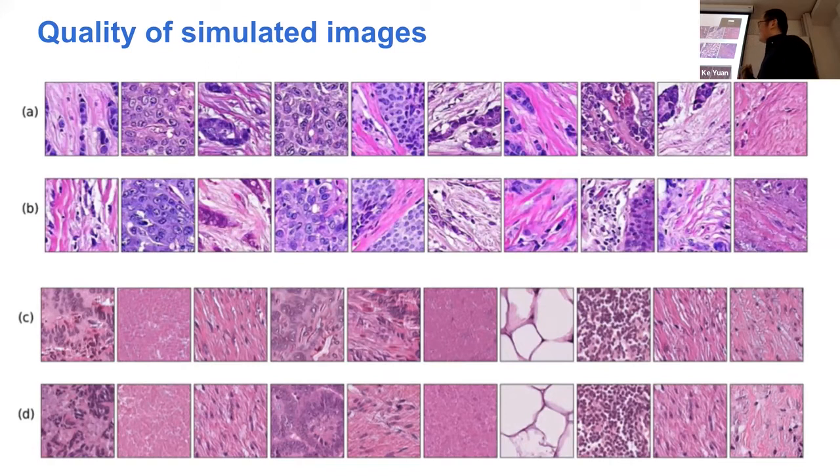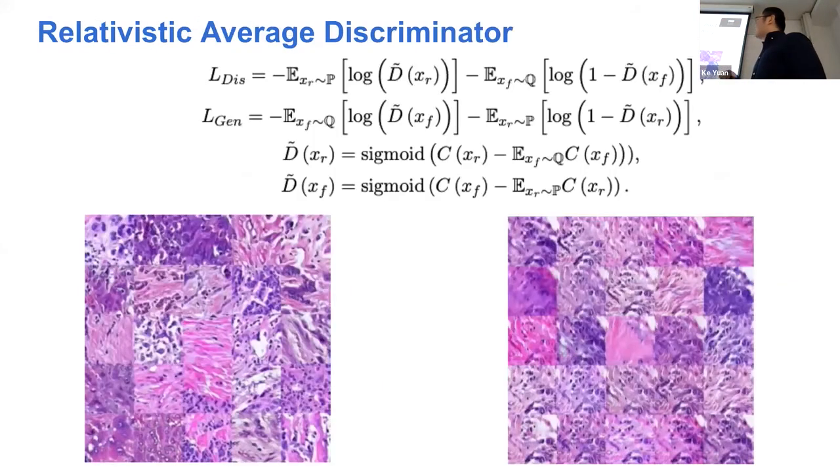So at this point, we're fairly convinced. Of course, you can also assess the FID metrics to have a quantitative measure of the actual quality of the data. But the point is that we're happy that we are able to generate good enough images.